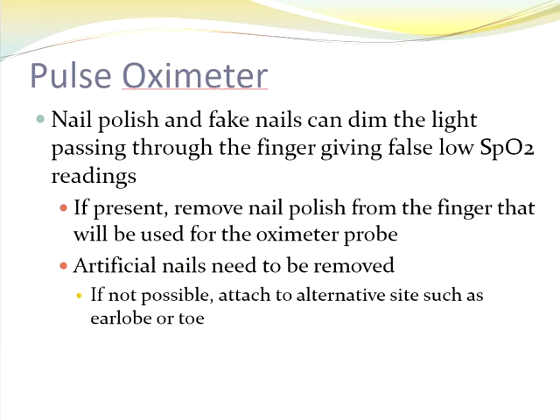They won't do studies on patients that have shellac nails or anything like that, and the patients have to come back after they've been removed. This is all stuff that the patients are prepped on ahead of time, so when they show up with fake nails and nail polish, it shows a lack of them actually reading the instructions.